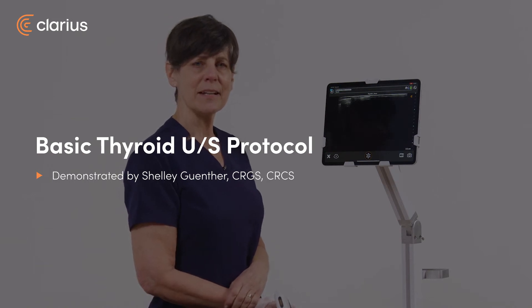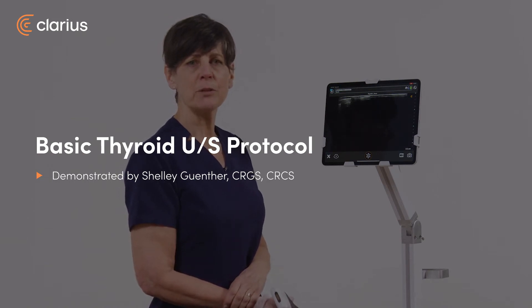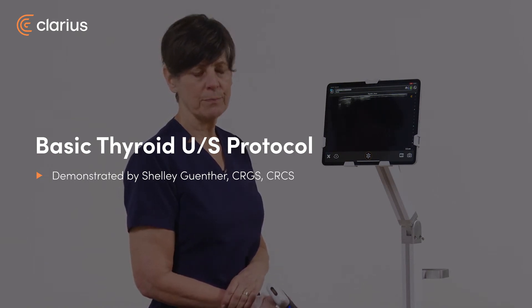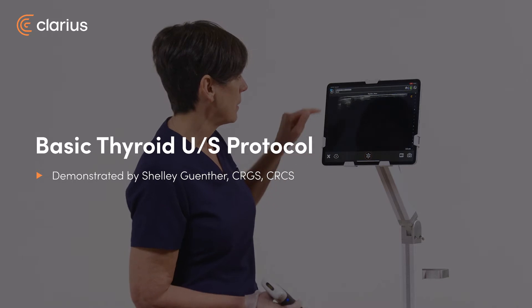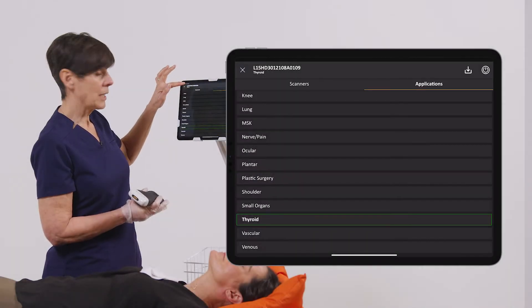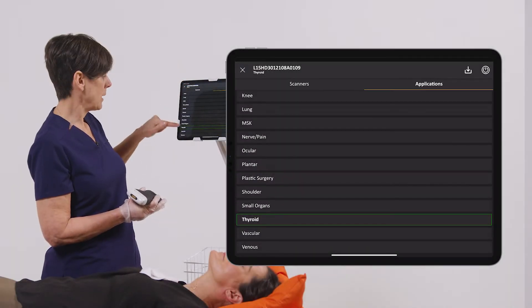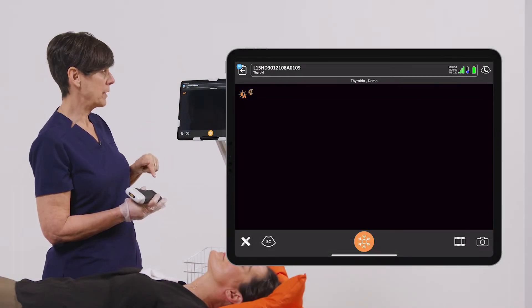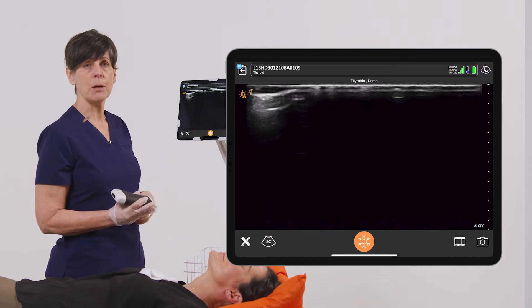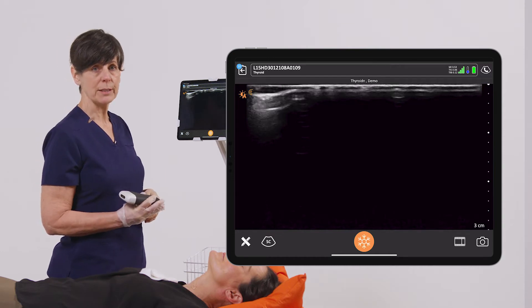Hi, my name is Shelly, and today I'm going to show you how to do a basic thyroid ultrasound. I'm going to go into the Applications menu and select Thyroid. This ensures that we're going to get the best imaging possible of the thyroid gland.